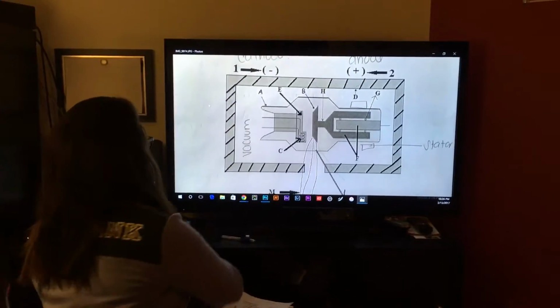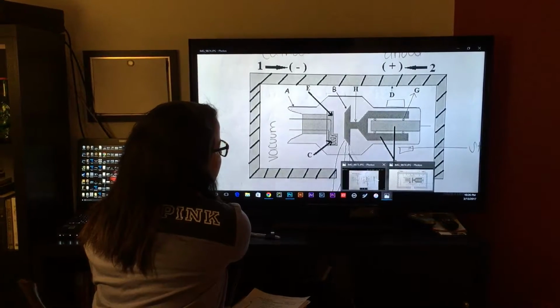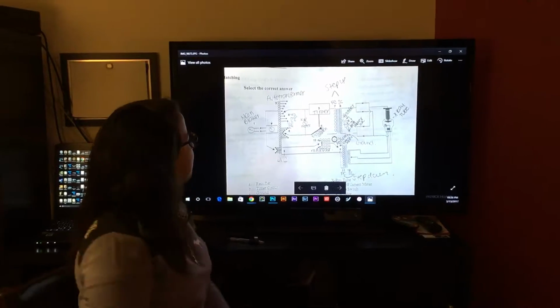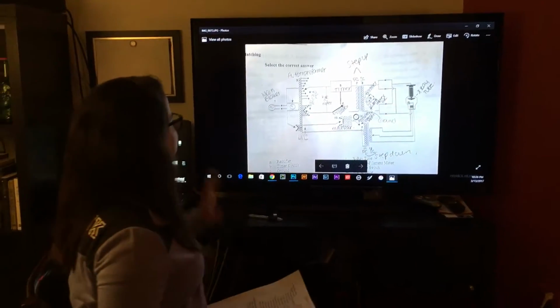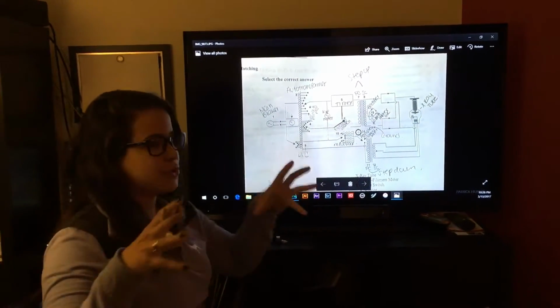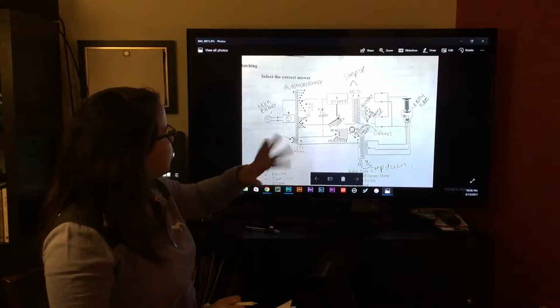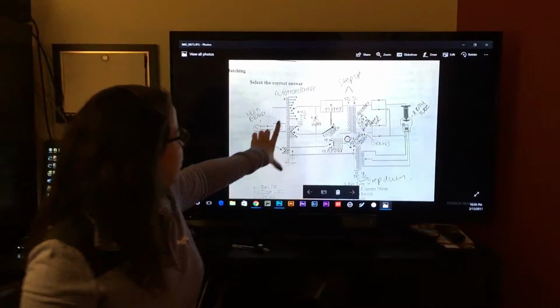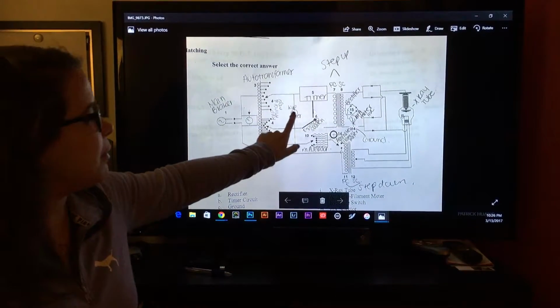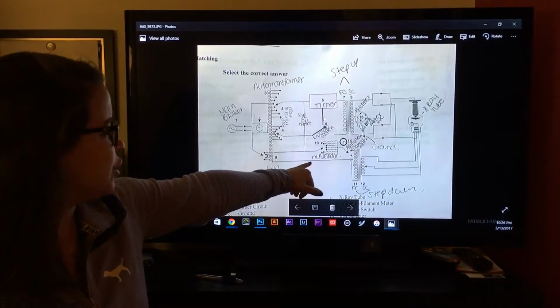We're gonna go over real quick the console, which is this right here. This is what we usually play around with, which is the actual console until you get to the X-ray tube. Just a quick overview, we have the main breaker, the autotransformer, we have the kVp minor and major, the kVp meter, the timer, mA selector.